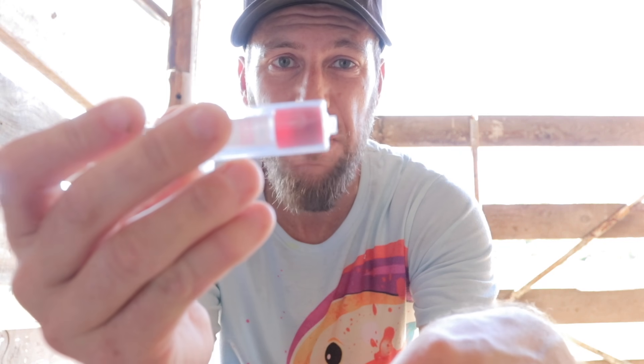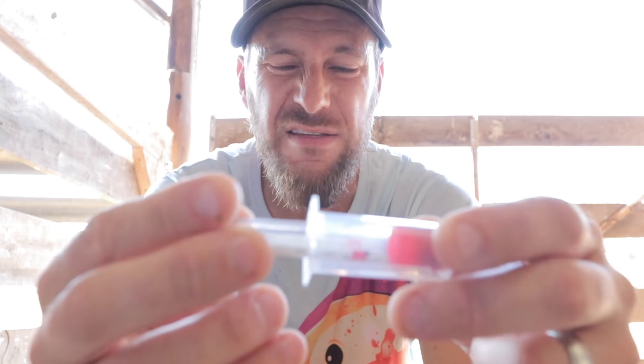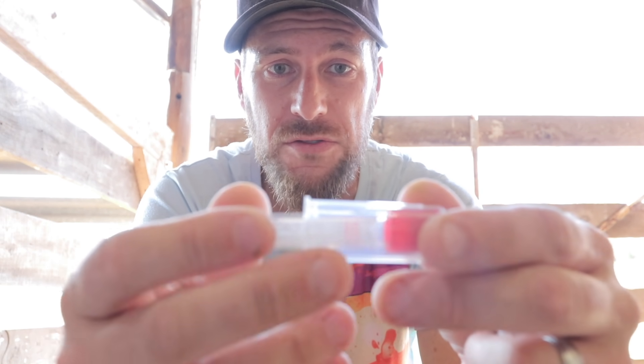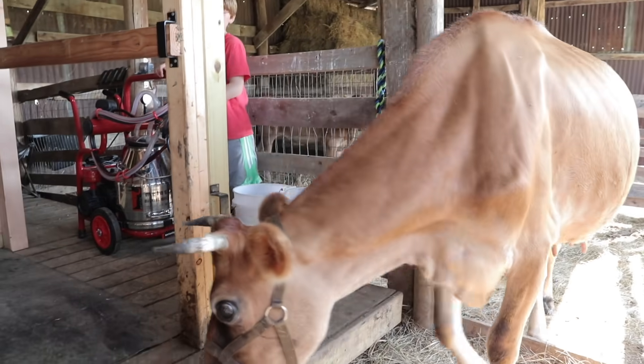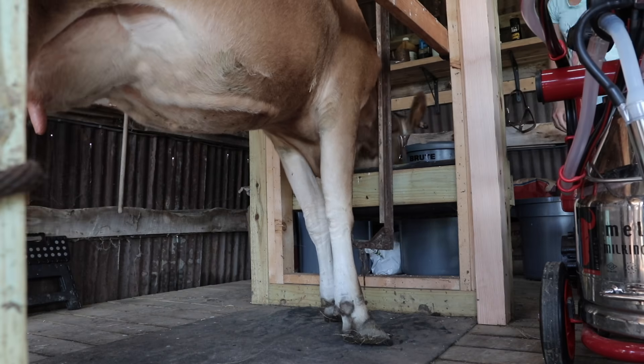You can't do it until she's passed 28 days from her breeding date, and it's about 39 days right now, so we're in the clear. You can do this a number of ways - you can do a urine test or a milk test. Those are much simpler but far less accurate, and a lot of people have had false positives or false negatives from those tests. So this is the most accurate way.